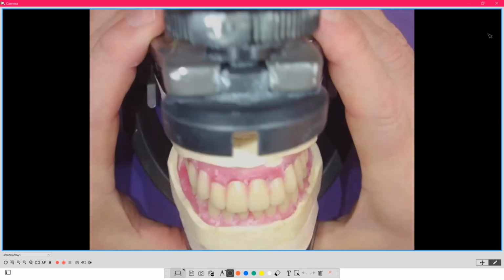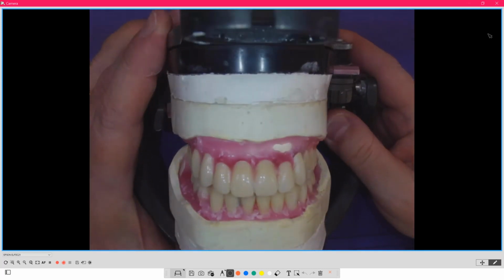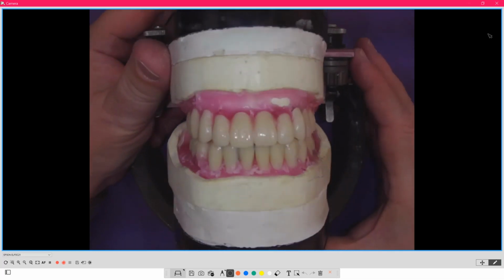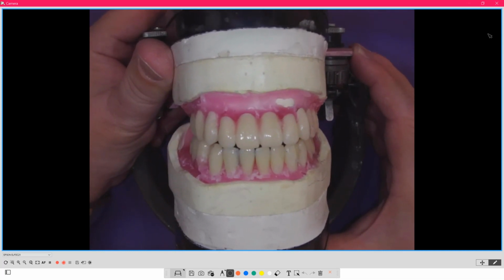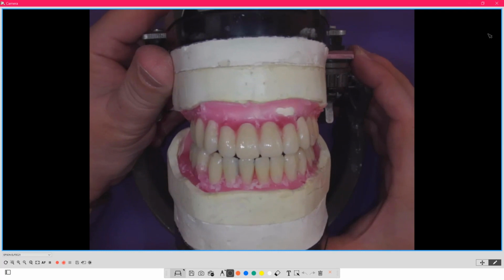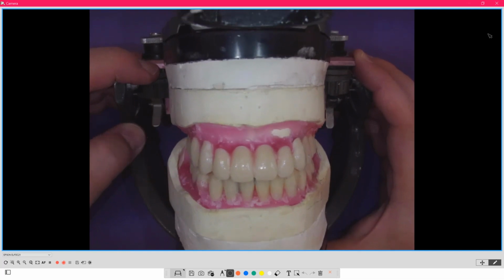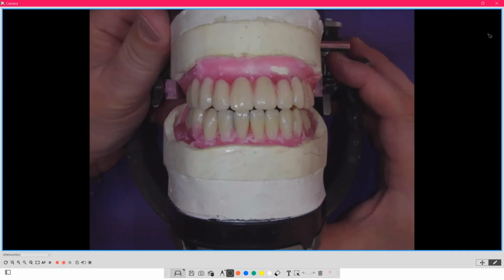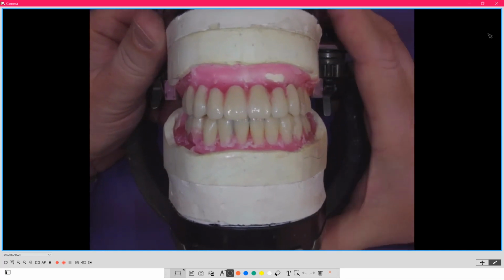As we slowly start to wrap up, and we have about 5 minutes left, I want to show you this. This is a setup. Yes, I used a little bit of different colors on here just to show, but this is how we check. We are taught to do this and check on an articulator to make sure that the denture teeth work. Nobody out there on this planet can reproduce this, because you've locked this condyle into position and now you're rotating this condyle. You can't do that in real life because one condyle doesn't fuse and lock, does it? So I don't do this anymore on an articulator when I set teeth.